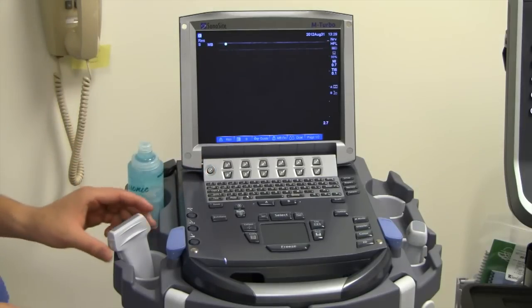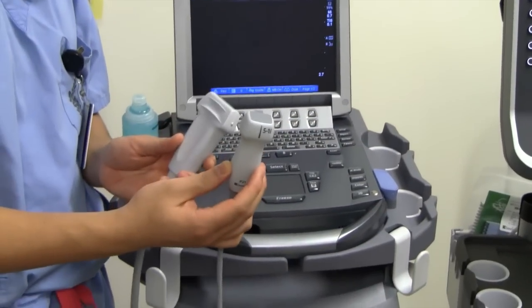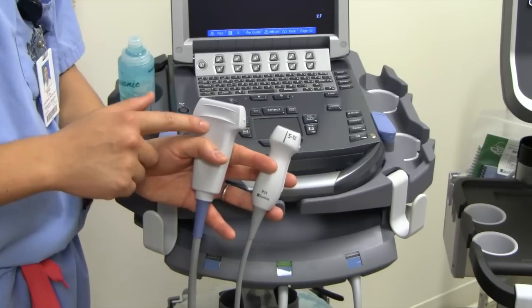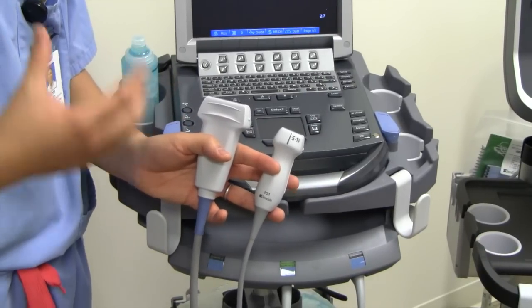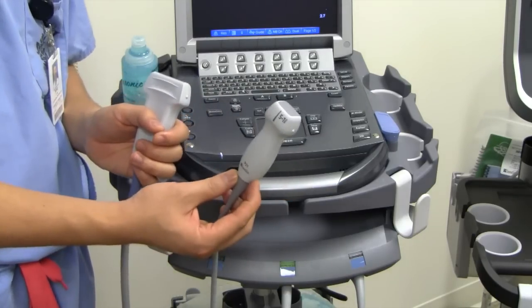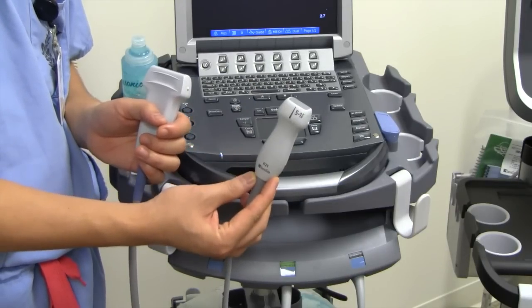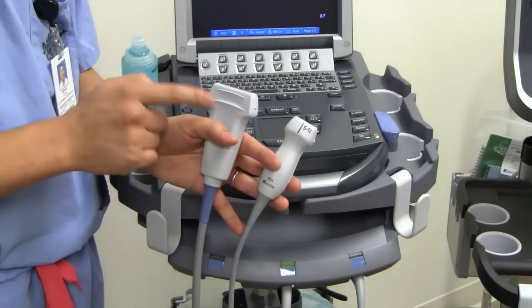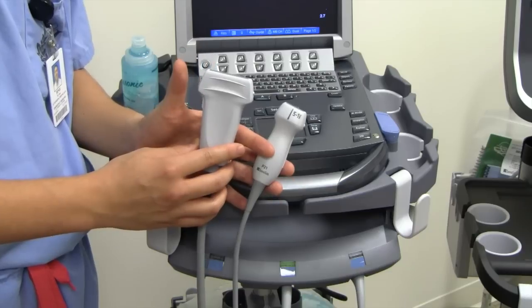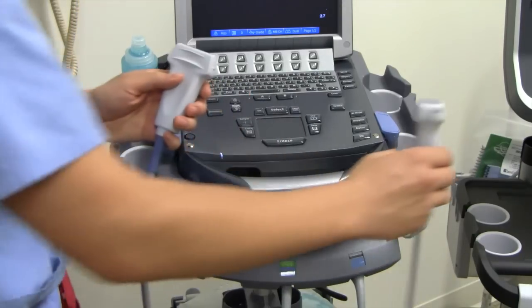The next thing you have to know how to use is the transducer. There are two transducers that you'll need to learn how to use. One is the linear probe, and this is for superficial structures — anything about six centimeters or less you can use with this. The other is for deeper structures, so for your cardiac exams or your abdominal exams, you're going to be using that type of probe. In the beginning, we're going to be using this linear probe first because most things we're going to be looking at are vessels and nerves.